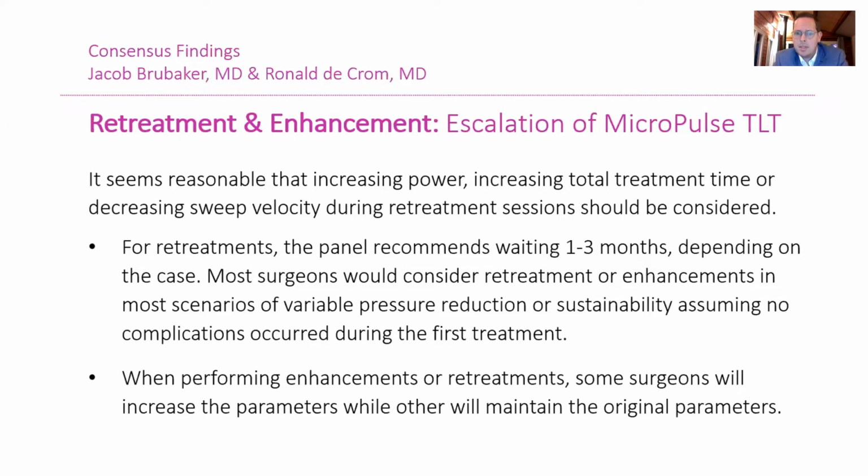For retreatments, this panel recommends waiting 1 to 3 months after the primary treatment, depending on the patient case. Most surgeons would consider retreatment or enhancements in most scenarios of variable pressure reduction or sustainability, assuming no complications occurred during the first treatment. When performing a retreatment or enhancement, some of us will increase some of the parameters, and you can think about a 25% increase in total treatment time, for example, adding an extra sweep, increasing the total energy you want to deliver in the eye, while other panel members will maintain the original parameters.